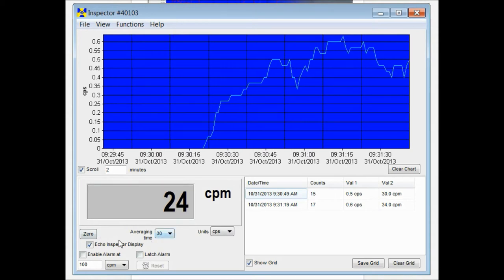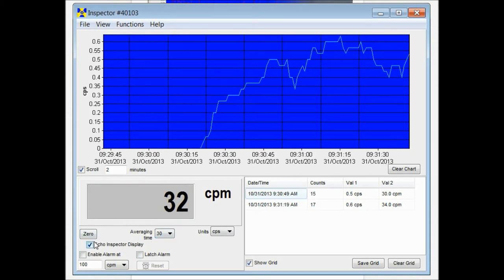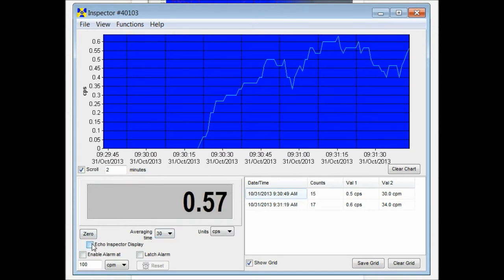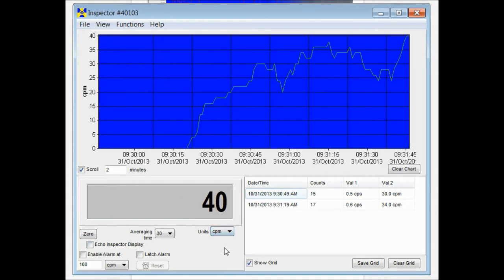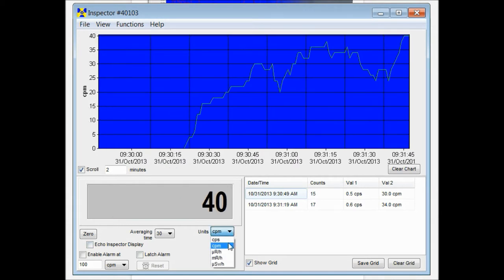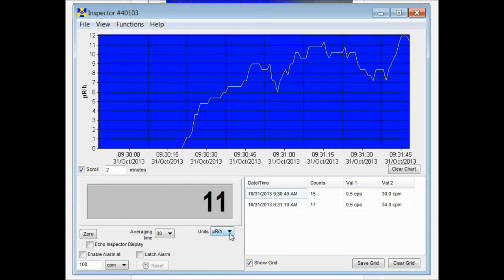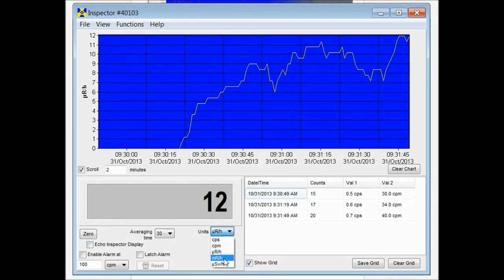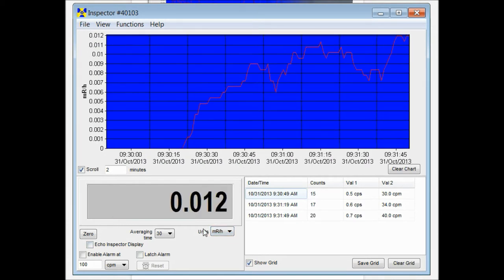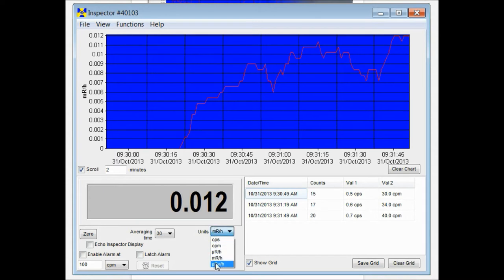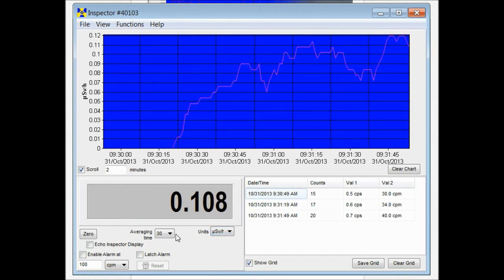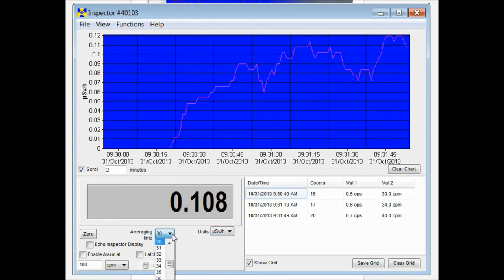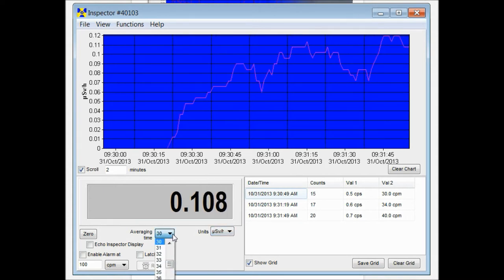You can also turn off the echo of the display and change the settings to read in whatever units of measurement you choose. A couple different ones available. You can also change the averaging time.